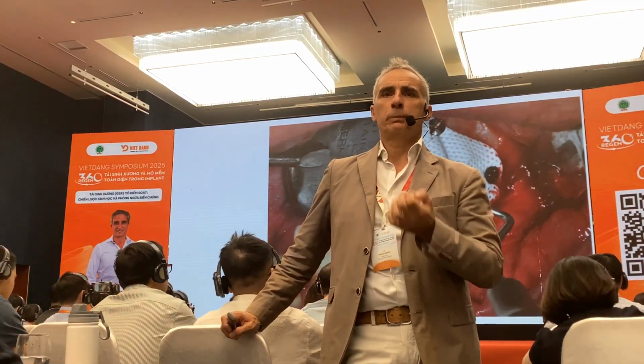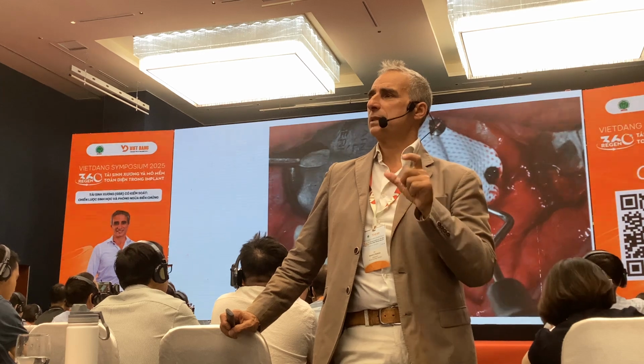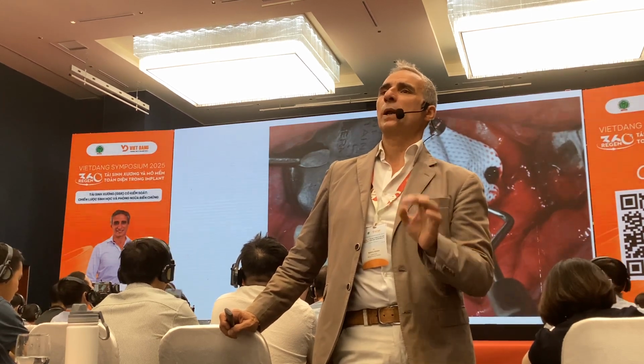We pre-shaped the membrane with a probe in order to define this dimension with precision. We wanted to have 12 millimeters in the molar area and 8 millimeters in the premolar area.